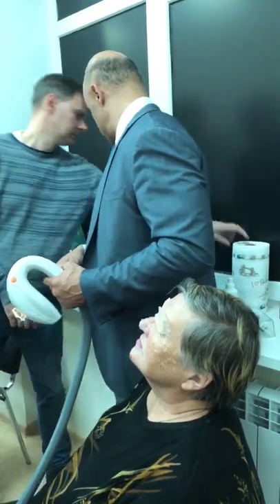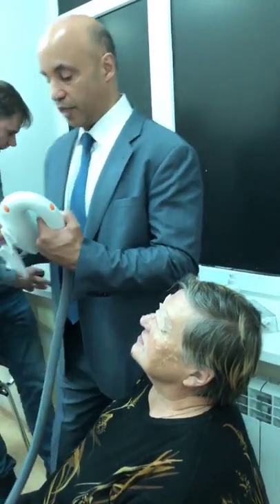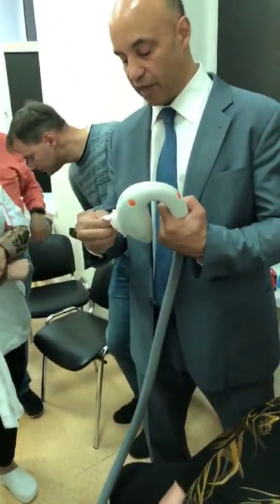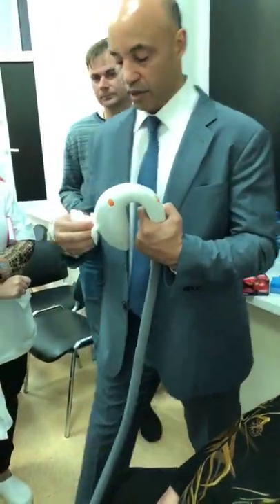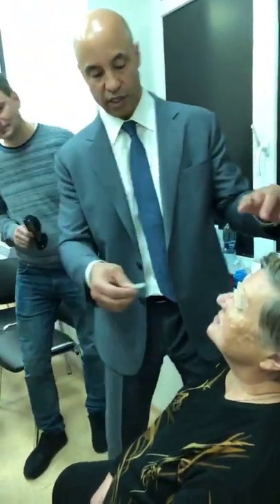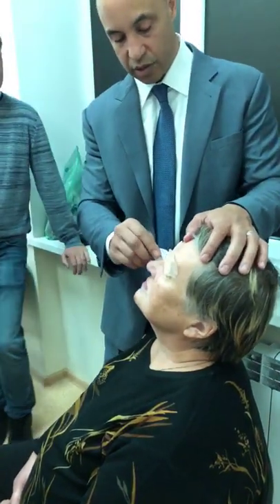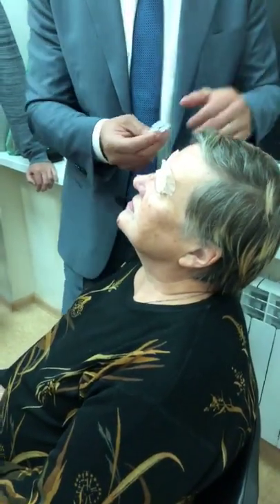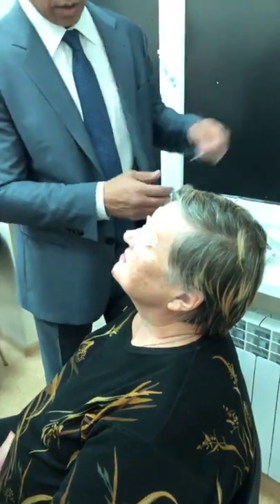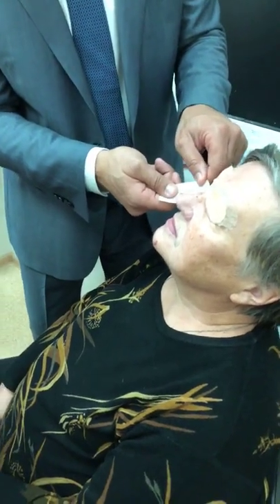Then we need some Kleenex. So right after you do the treatment, you just clean this off. Remember, the xenon flash lamp, this IPL, kills bacteria, so you don't have to worry about any kind of bacterial growth. Then an easy way so that you're not using a ton of Kleenex is you take what you use for the eye shields, and this will save you from using a ton of Kleenex.